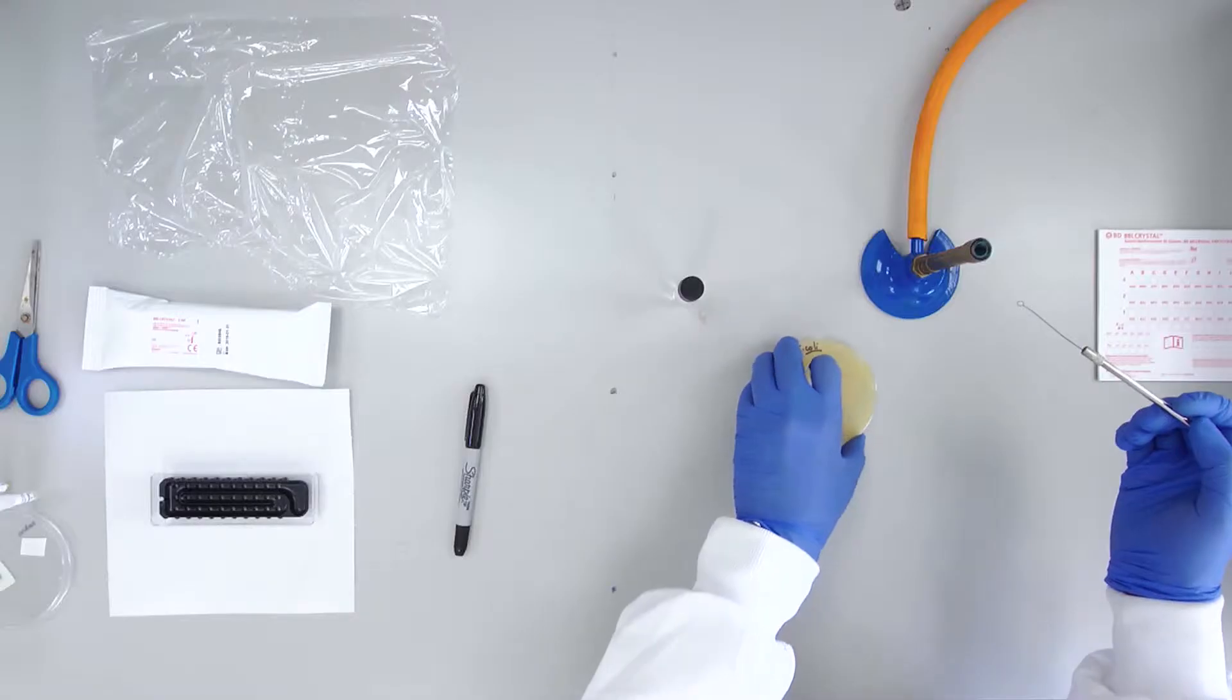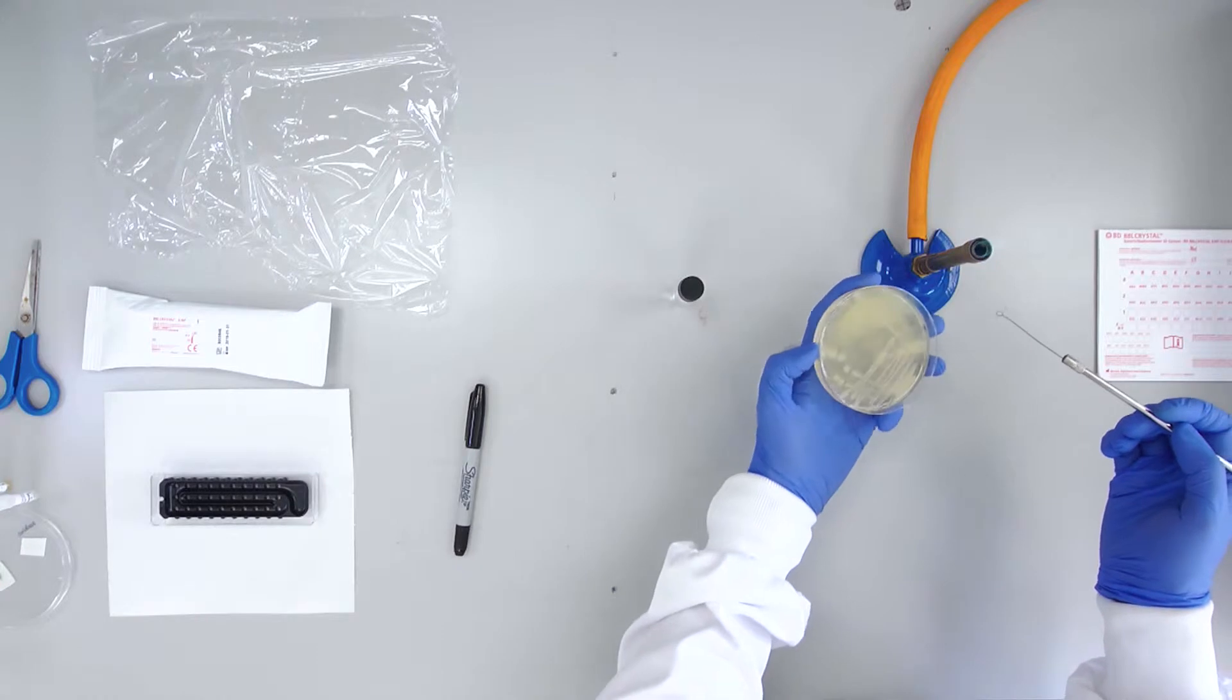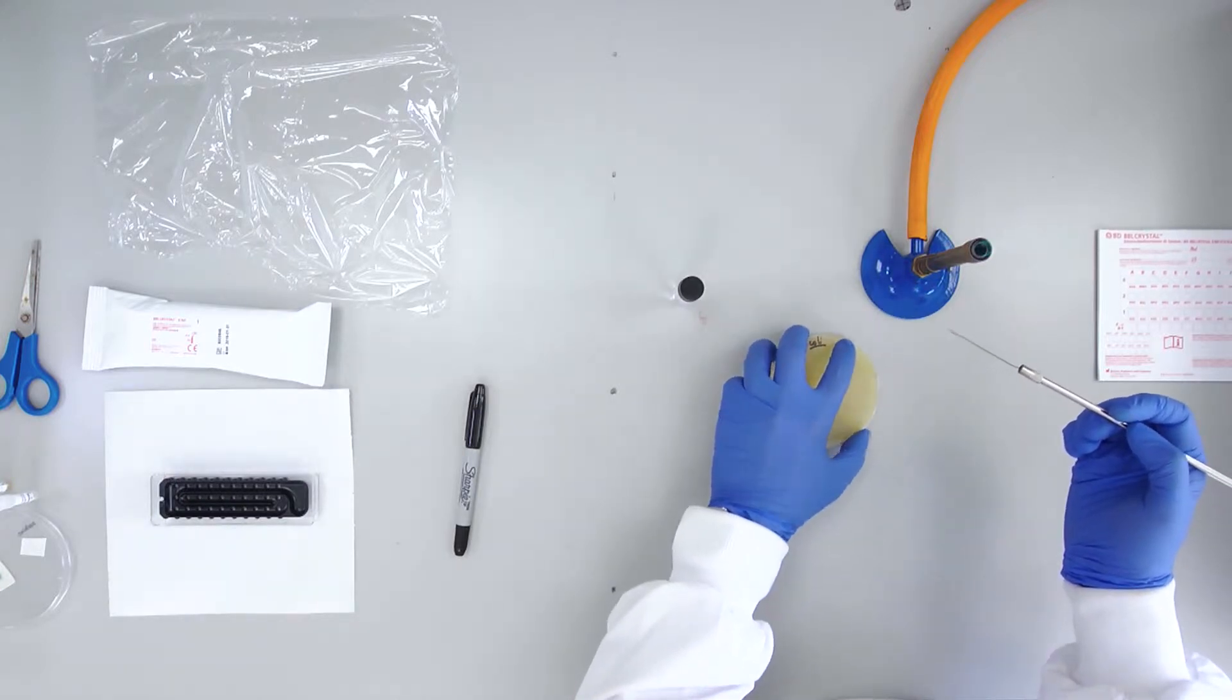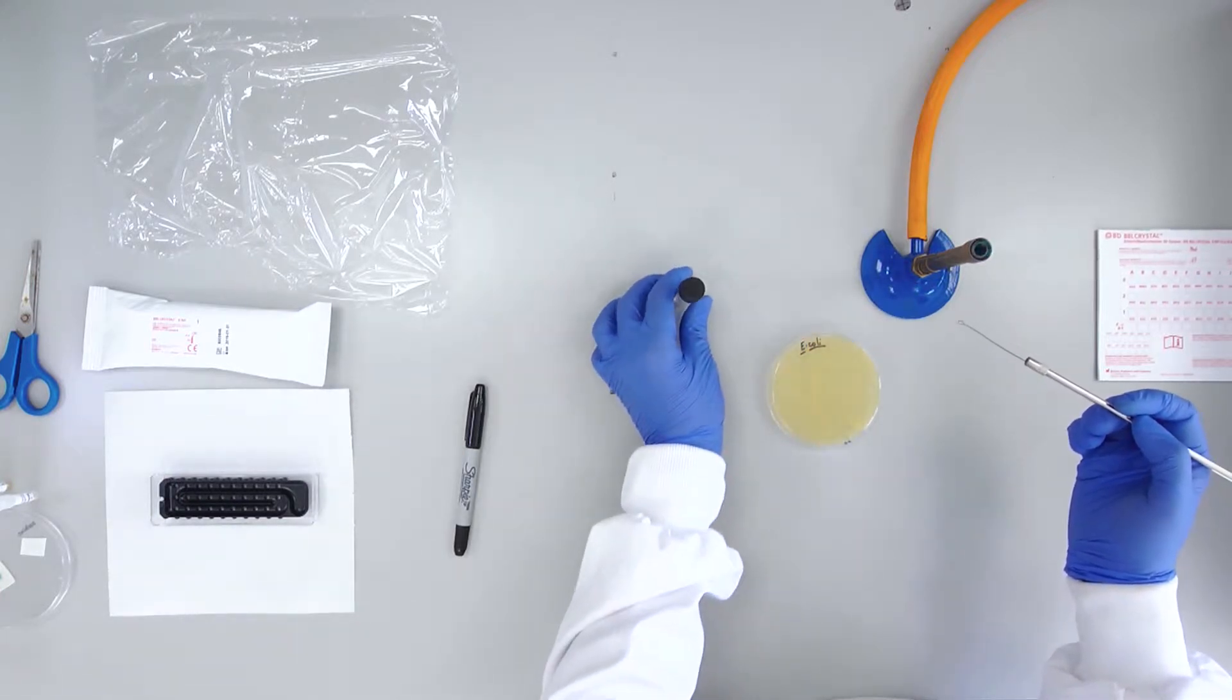Select a large isolated colony from the plate. Aseptically suspend the colony in the BBL diluent supplied.